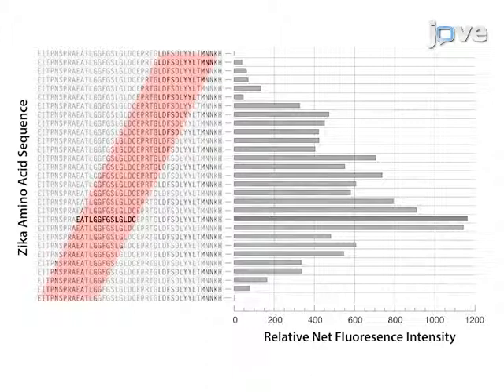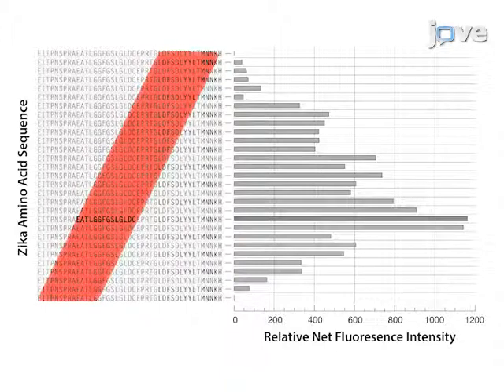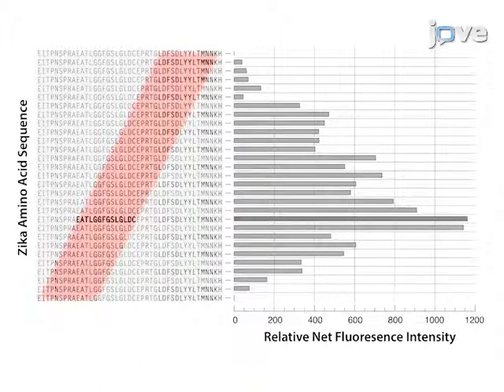Shown here is a representative Zika virus epitope consensus sequence reacting with IgM in the host serum sample peptides. Peptides from the epitope consensus sequence are highlighted in red, and the peptide with the highest fluorescence intensity is marked in bold.